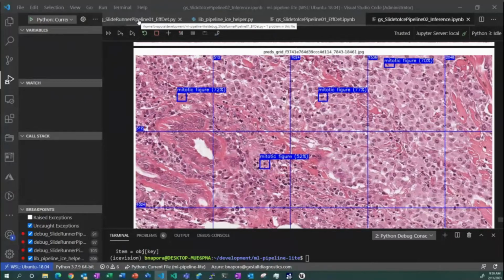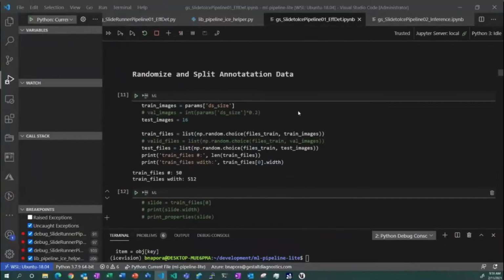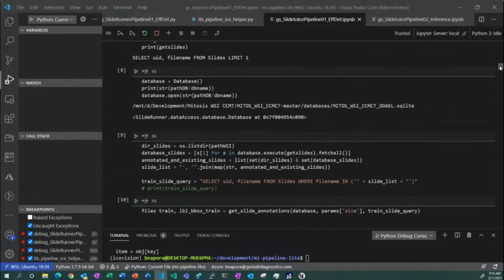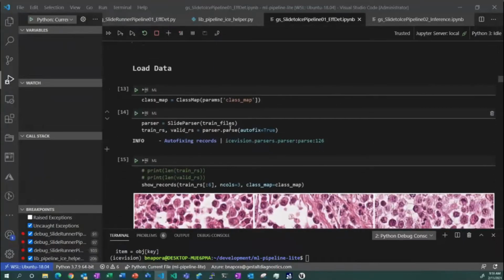And we are at the top of the hour. Hopefully that was interesting. I'm not sure many of you have done your own work in creating a custom data parser, but that's the work that I've done in taking the pipeline that the folks at Friedrich Alexander have created and transforming that into an IceVision pipeline.